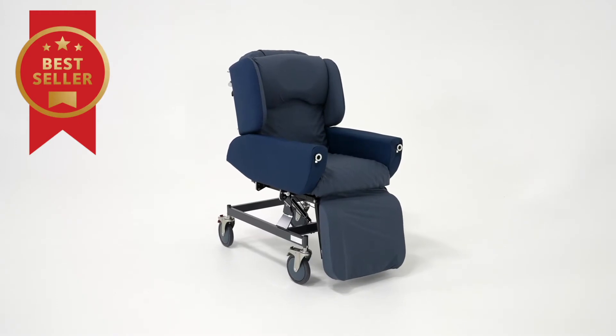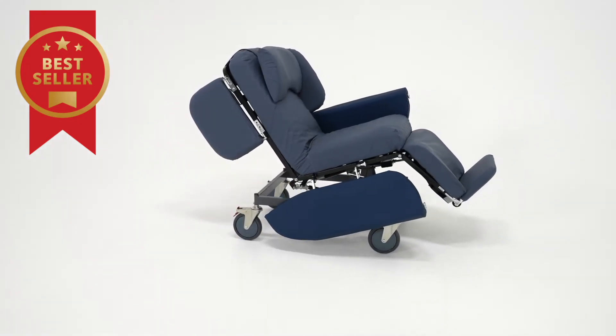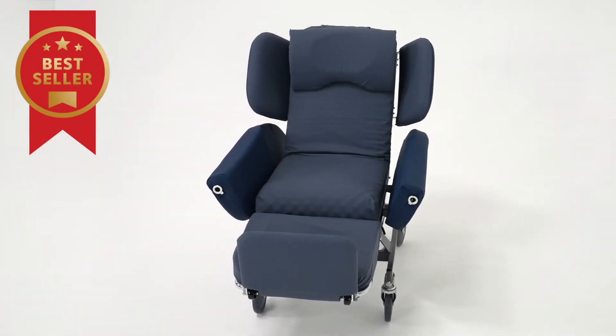Hi, I'm Ruben and I'm Dee. Today we'll be taking you through our most popular chair, the Regency Care Chair. As one of the most popular care chairs on the market today, the Regency has gained its status from a proven track record across the health and home care community.